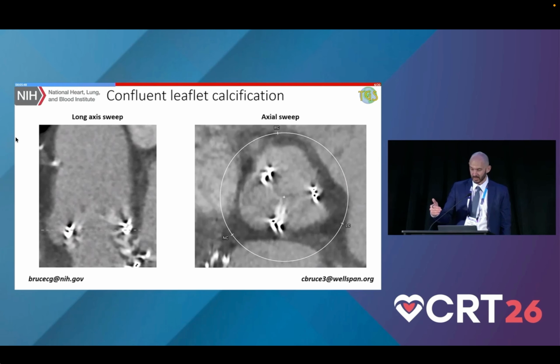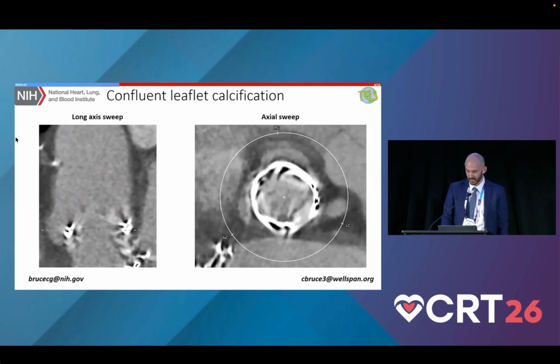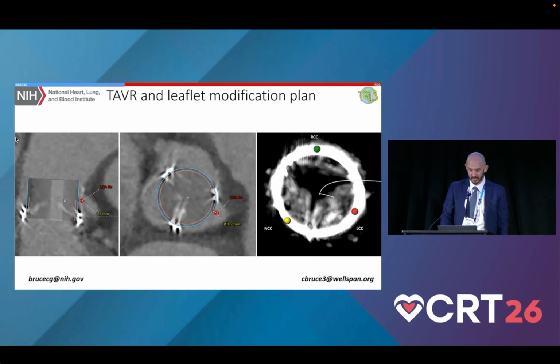Also interesting, if you look at the eccentricity of where the left main comes off right beside the left-right post. Even if we were able to do a leaflet modification, it's not ideally placed. I'll just skip this slide.